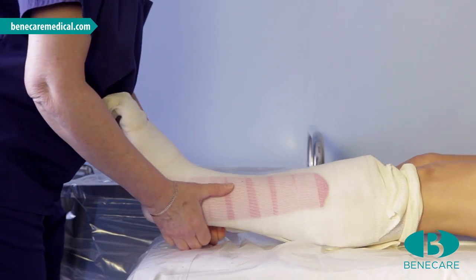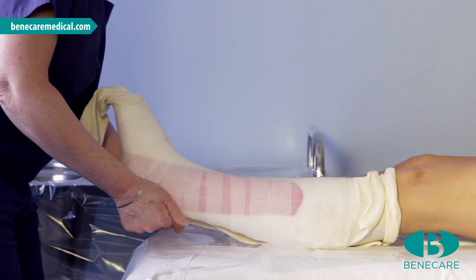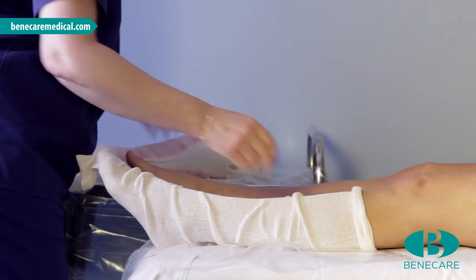Turn the patient back over, put fingers under the heel, and slide the cast off the patient's foot. Remove the excess stockinette from the patient's limb.